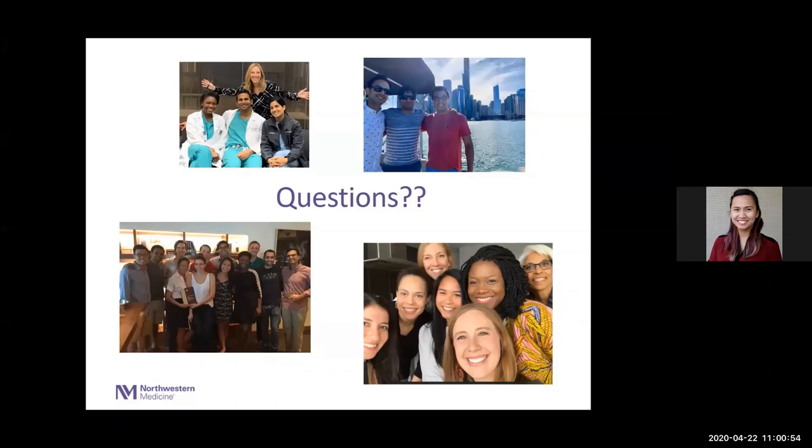She'll tell me what's going on and tell me to start filling. Then I'll sneak in there at a certain time when I think I need to be there for the important parts of the study. If she sees something going on, she'll stop filling and come get me. I do like to be in there for a lot of the important part of the study. So if the patient has a 300-400 cc bladder capacity, I'm not going to stand there while they're filling up. I'll go see a couple other patients and then pop in there, and she'll let me know.